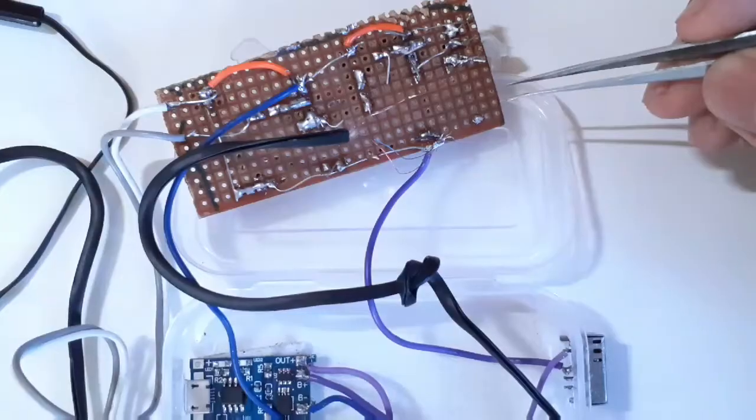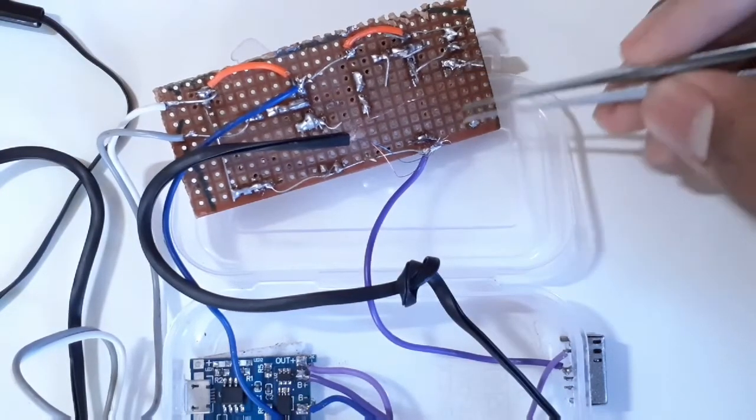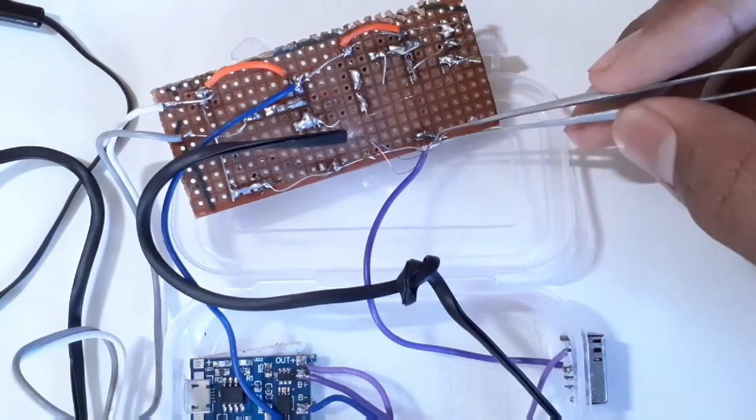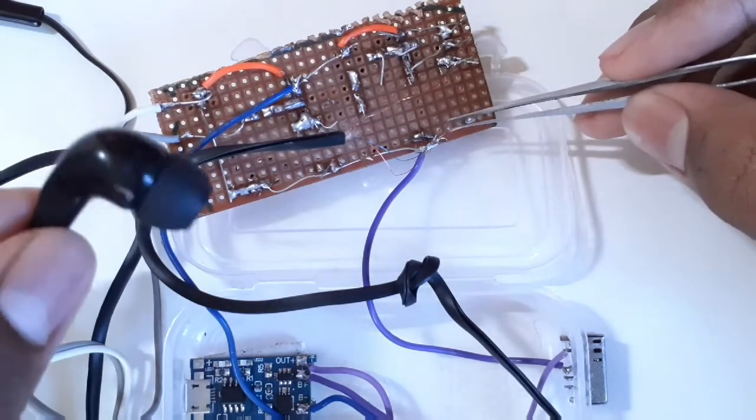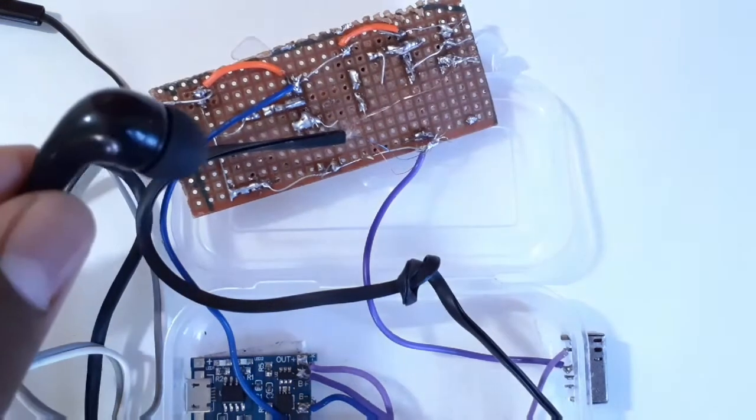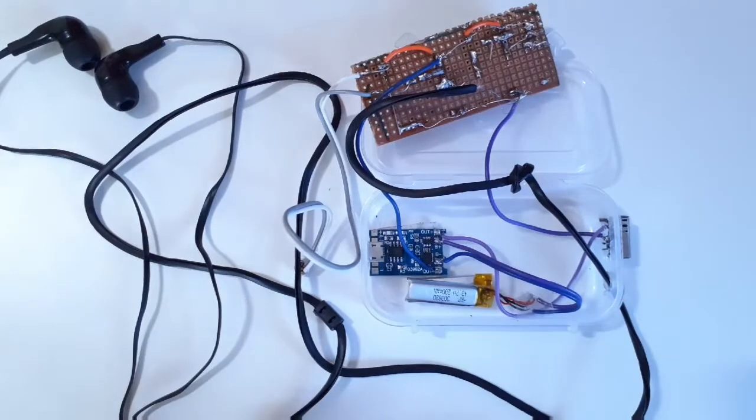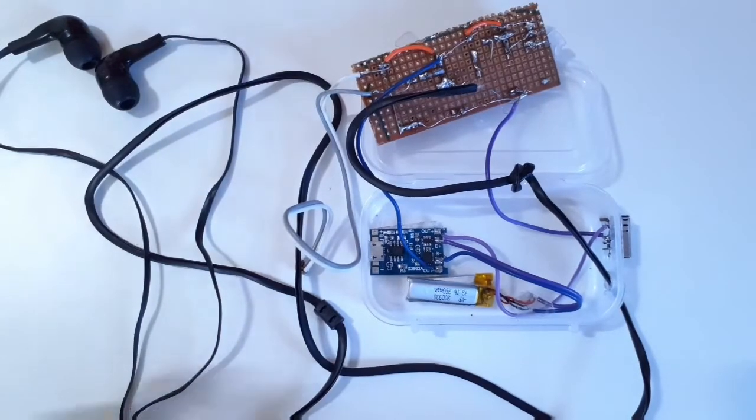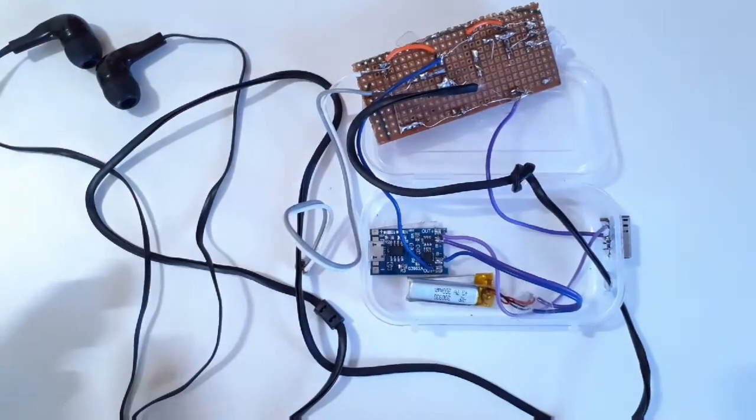Next we need to solder the wires of this earphone onto our amplification module for the output of the audio. And here is how it looks like when it's completed.